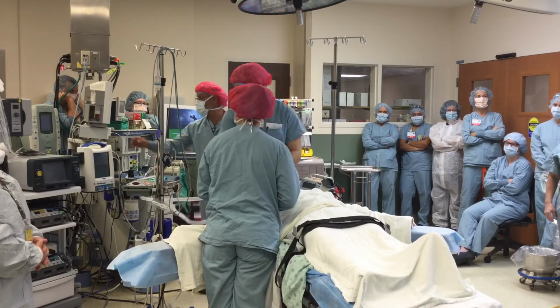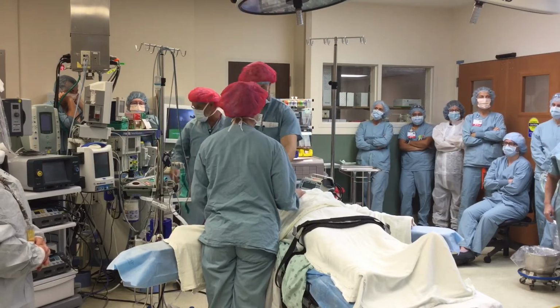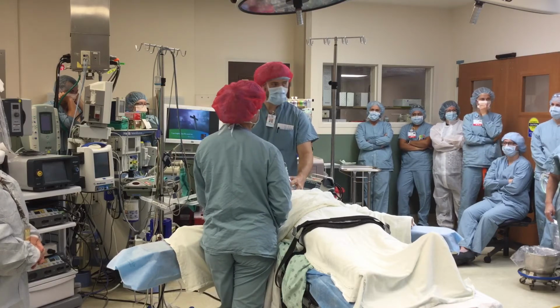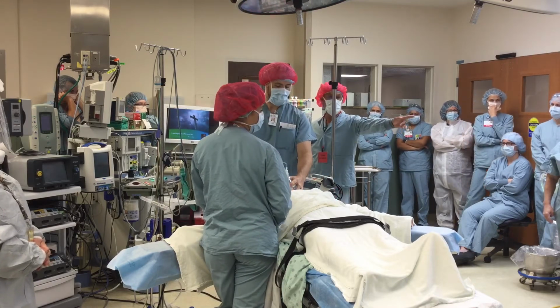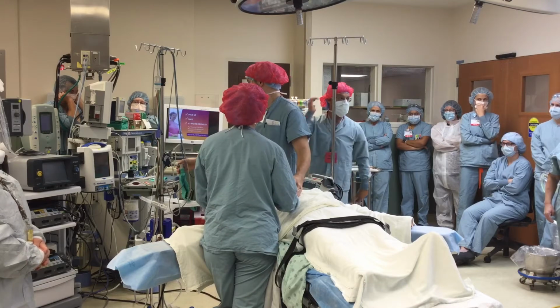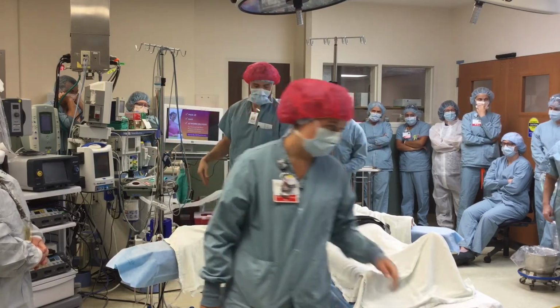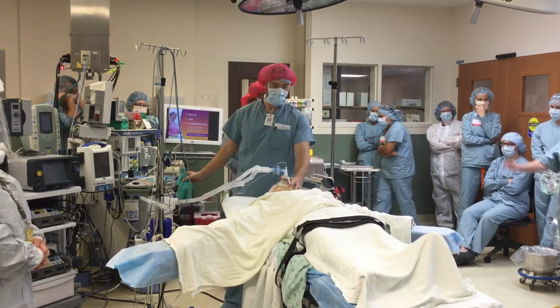So we have monitors on, we're applying oxygen as well. We're going to take care of the airway. We have a shockable rhythm. Let's put pads on. Please call for help. We need crash cart in the room.